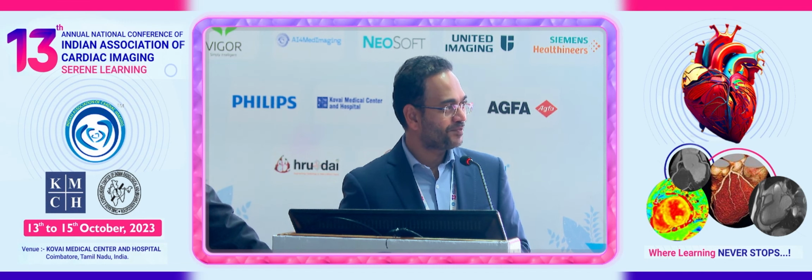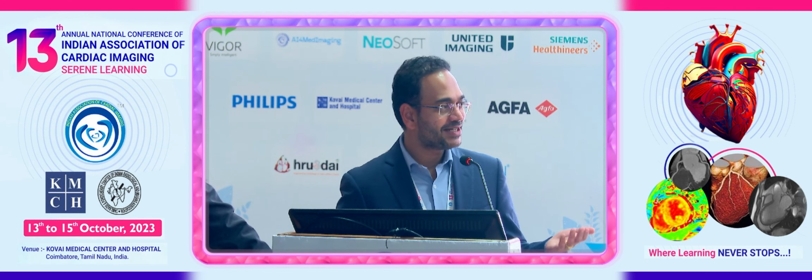I thought it was 5. But you said it's 2. So in the United States we don't repeat a coronary CT. I think that's one of the reasons.